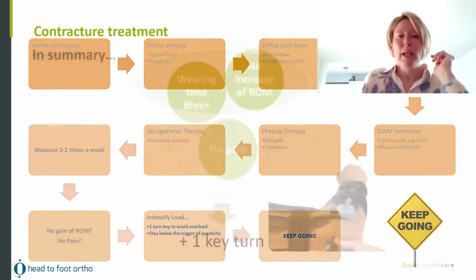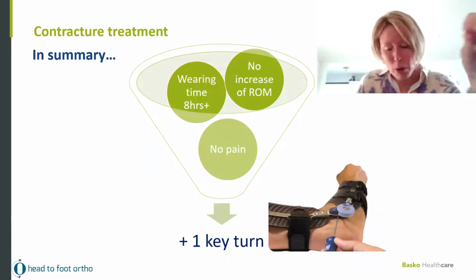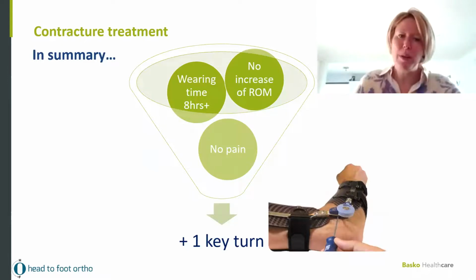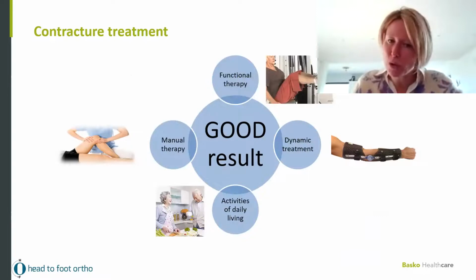And then it's a matter of keep going. In summary, you increase your wearing time. The more you wear it, the better the outcome will be. If you have no increase of passive range of motion, and you don't have pain, then you can just turn up the load by one key turn. The best result will be with a combination of factors: functional therapy, manual therapy, and implementing the range of motion in the activities of daily living, in combination with your orthotic treatment. You will have a beautiful result.